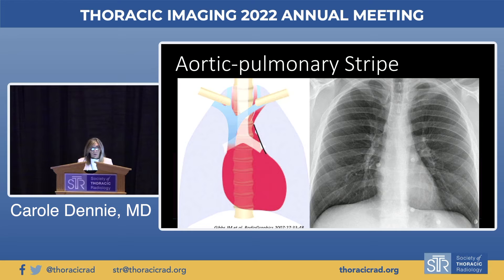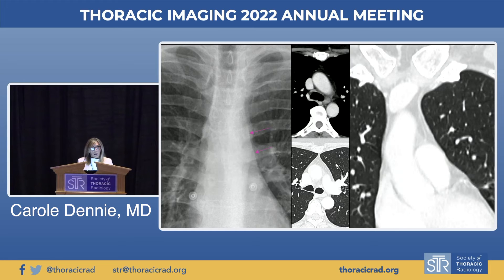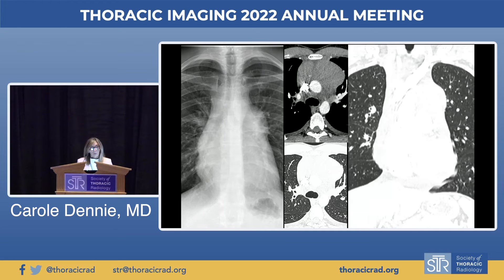The aortopulmonary stripe is perhaps less commonly discussed. It's formed by the mediastinal interface of the anterior pleura of the left lung in contact with the mediastinal fat anterolateral to the left pulmonary artery and aortic arch — usually a straight line. On CT it corresponds to the pleura abutting the fat and/or the lateral aspect of the ascending aorta. It can be seen as a stripe in pneumomediastinum, outlined by gas in the mediastinum and air in the adjacent lung, or caused to bulge by anterior adenopathy.